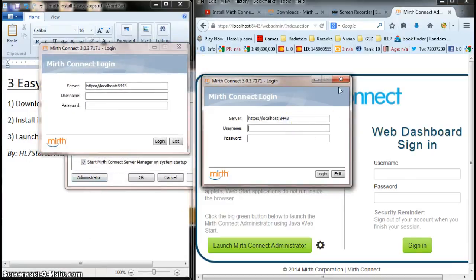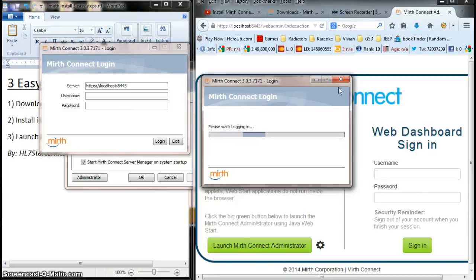And by default, I believe the username is admin and the password is admin. Yes.